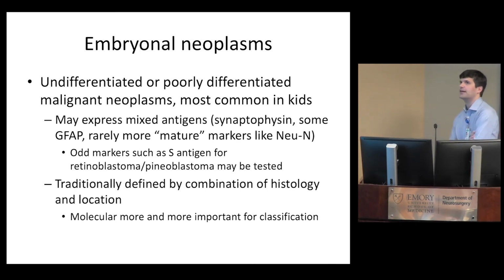So you can look at the cells of an infiltrating glioma, and you say, okay, those guys look kind of glial. They have maybe a little pinkish cytoplasm, some spiculations coming out of them. It looks maybe fibrillar. An undifferentiated tumor cell just doesn't look like anything from the normal body. It may look like something that one would run into in a fetus, something that's developing. But these are just tightly packed nuclei that proliferate, all right?